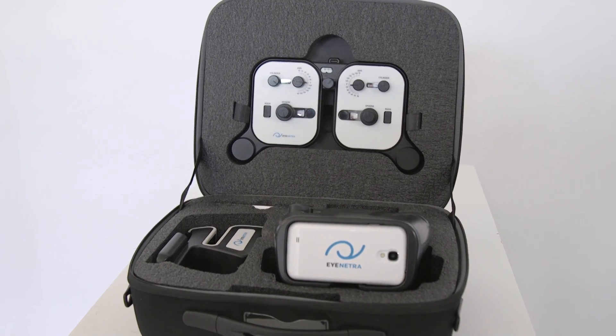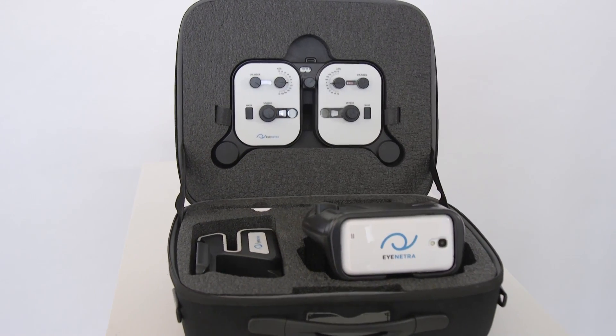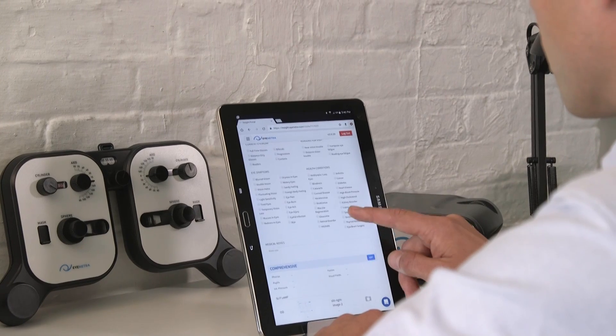Today we're going to take a look at iNetra's mobile clinic kit, the first all-in-one portable refractive solution for the eye care professional. Along the way, we'll show you how each device can impact your practice at home and how easy it is to set up a mobile clinic virtually anywhere with the addition of a simple tablet or laptop.